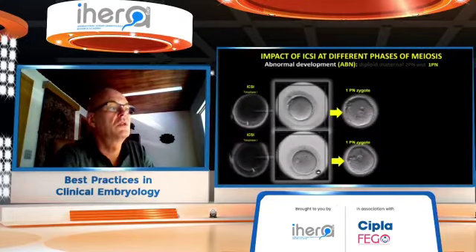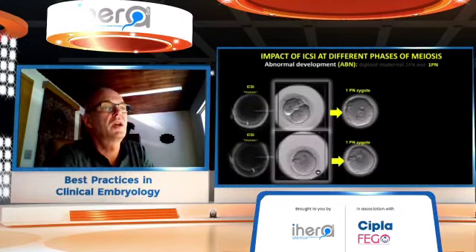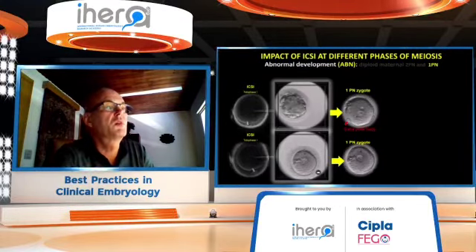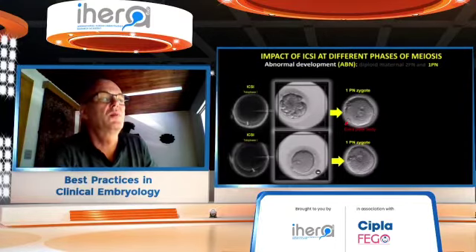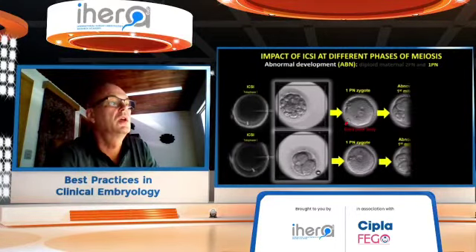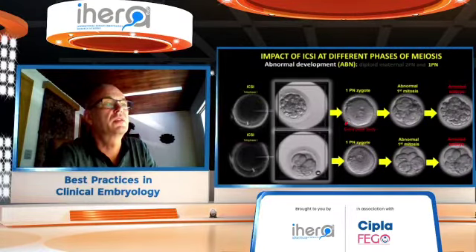Another anomaly induced by ICSI of immature oocytes is 1PN fertilization. No extra polar body extrusion was observed in 1PN zygotes. What could be the explanation of the missing PN? The resulting embryos cleaved abnormally and were arrested very soon.